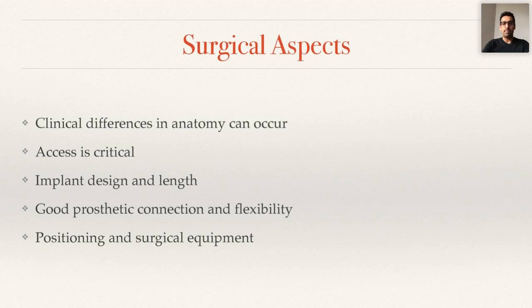You want an implant with a good prosthetic connection and flexibility. So what I'm referring to here is the BioHorizons implant has a Zimmer connection, it's a hex. And most implant companies that offer full arch solutions will have a straight multi-unit, a 17 and a 30 degree.